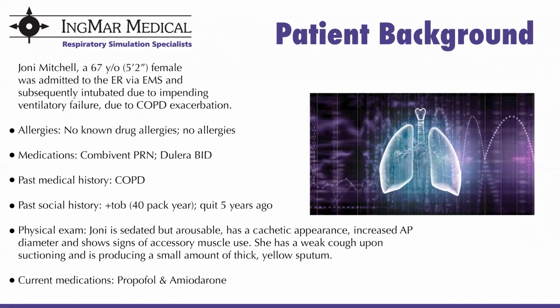Our patient today is a 67-year-old, 5'2" female who was admitted to the emergency room and intubated due to impending ventilatory failure. Initially, the patient is sedated but arousable. But for the sake of time, we have skipped ahead to the second stage today.